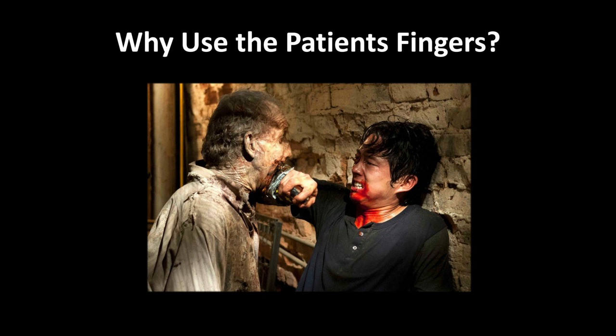Our hands should be the size appropriate for that patient's body. I've got pretty big hands, and if I'm dealing with a woman, my fingers are going to be bigger than that patient's, and vice versa. So we want to make sure we're using the appropriate gauge to assume that my patient can open their mouth to the position they need, where I can actually get a laryngoscope in the mouth.